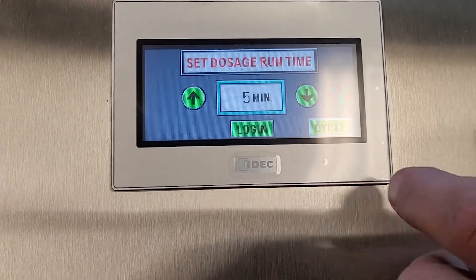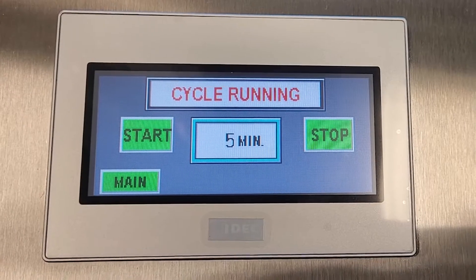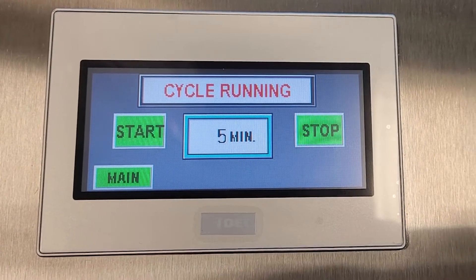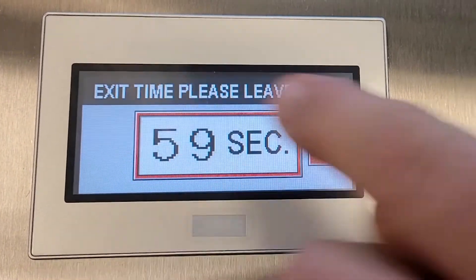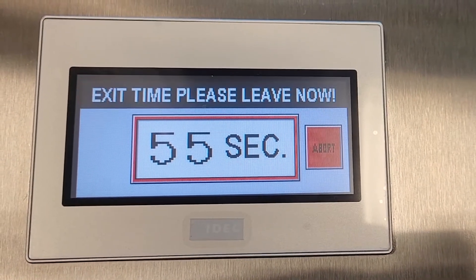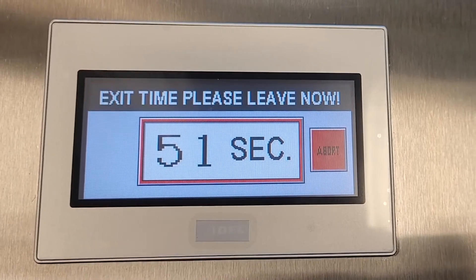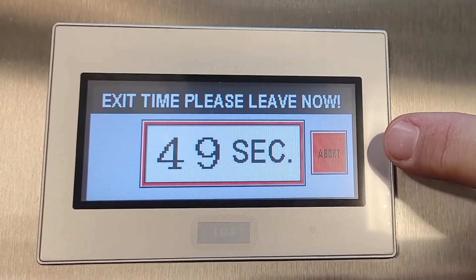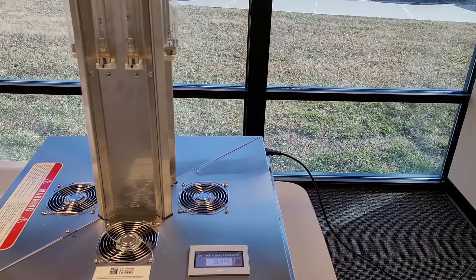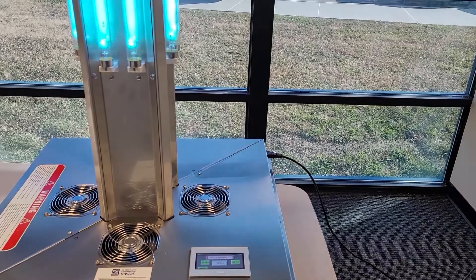Then press cycle. Press start on the LCD touch screen display to initiate the 60 second evacuation countdown. Keep in mind you can press the abort button to cancel the 60 second countdown and cycle run time. After the 60 second countdown is complete, the disinfection cycle will begin.